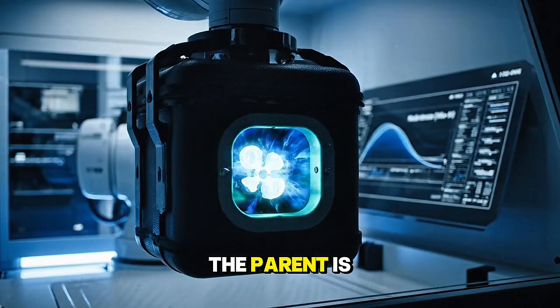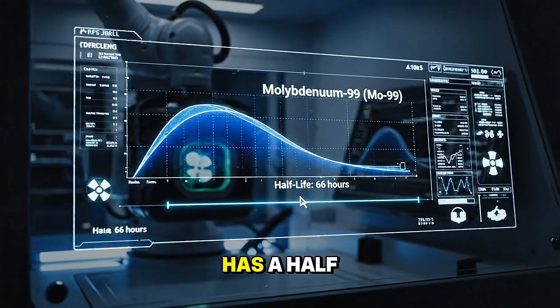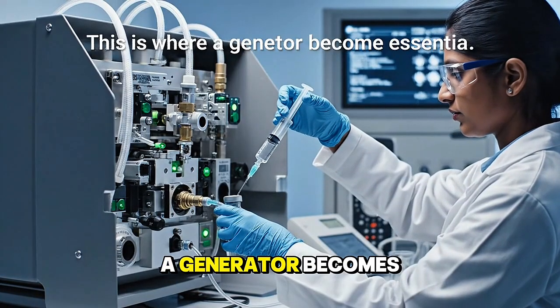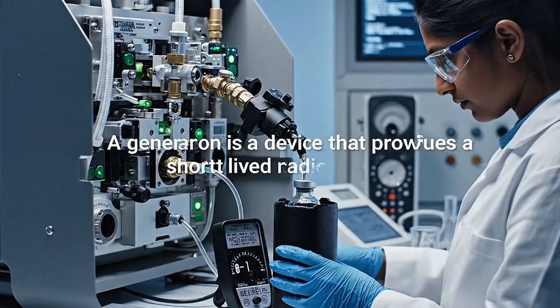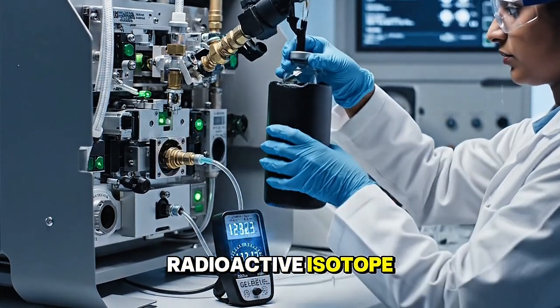In this case, the parent is molybdenum-99, Mo-99, which has a half-life of 66 hours. This is where a generator becomes essential. A generator is a device that produces a short-lived radioisotope.